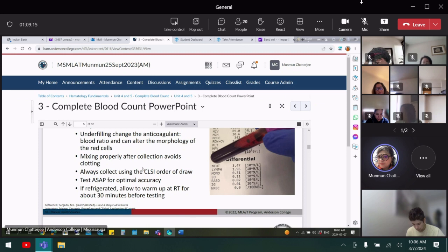Applied practice is moving on, but theory cannot change immediately because the majority are still using the old analyzer, which is understandable, right? It's a huge amount of money they have to invest, so they cannot throw it out. And there is nothing wrong with drawing it in the SST tube. Only it takes more time.